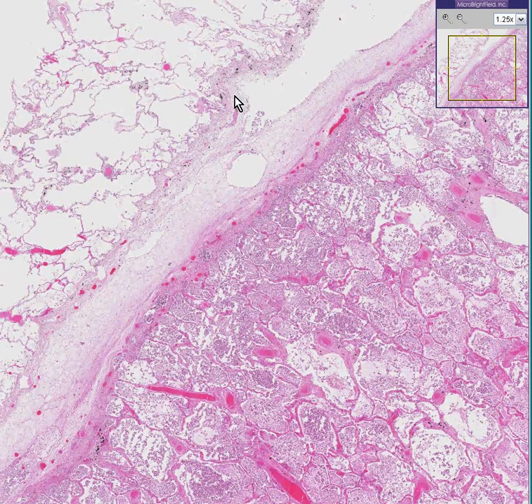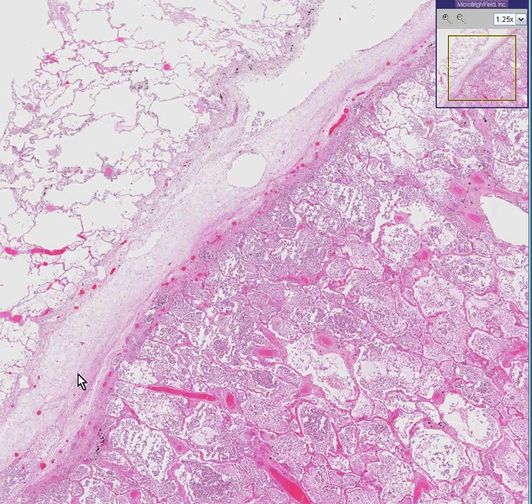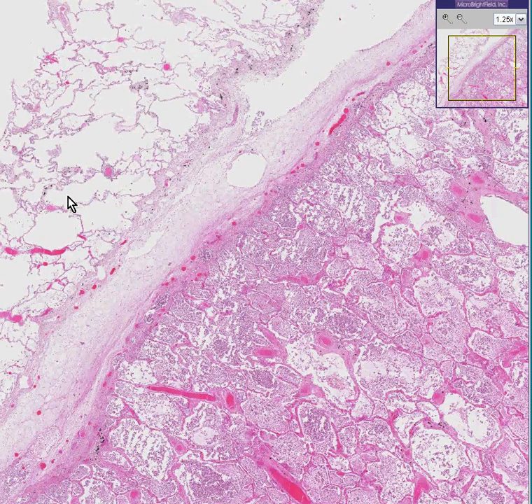This pleural surface appears to end abruptly at the pleural surface of another lobe of lung, and this would be almost certainly a major fissure. Notice that this lobe in the northwest is totally normal.